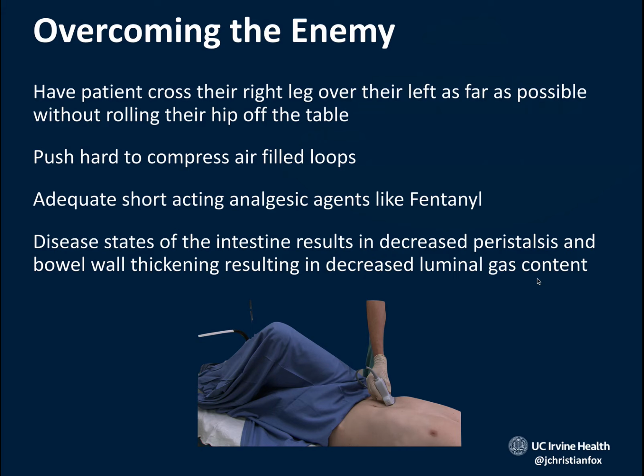And so when you have those things going on, having the patient cross their right leg over their left leg does seem to keep everything in sort of an anterior-posterior plane. So when you're making your compressions, the bowel's not squirting out to the side as much. I'm not really sure why we have them cross their right leg over the left leg, to be honest with you, but it does seem to help, and that's my theory, is that it keeps things more anterior and posterior.